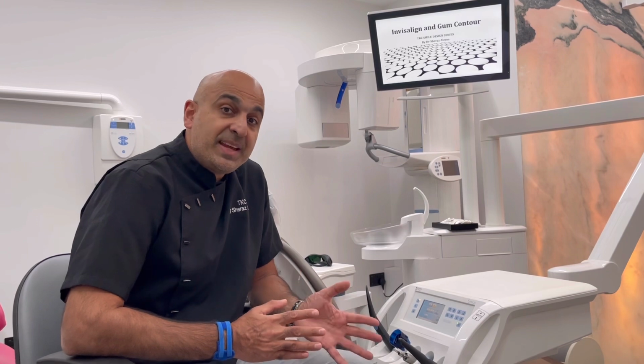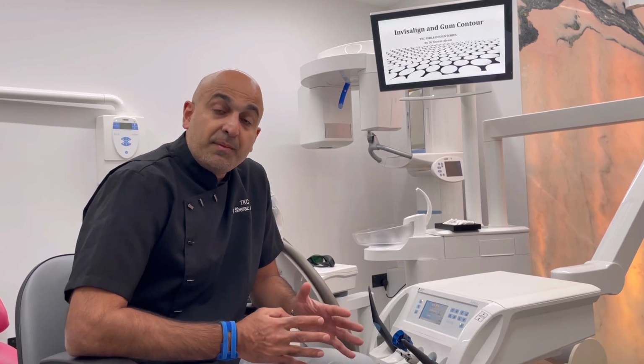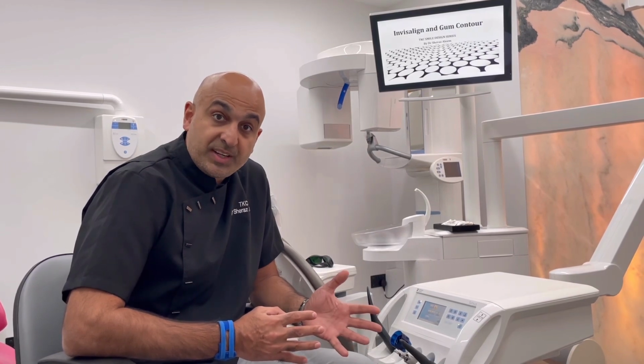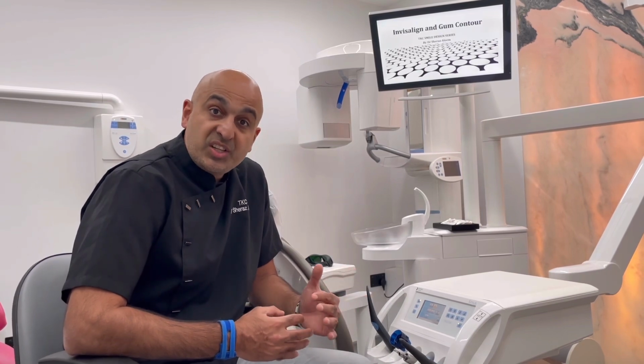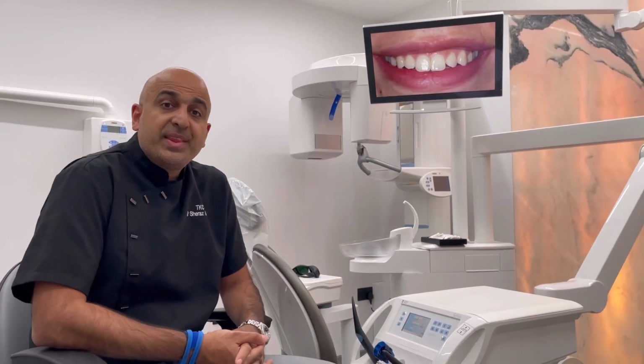contouring. Gum contouring is quite a well-known treatment now, and we use a laser for gum contouring, a water laser. This gum contouring can be very basic, if it's just one or two teeth that need the gum margins corrected, if they're not level, or it can be much more advanced if you're correcting a gummy smile with surgery. If someone's got a gummy smile, then we use the laser with water to correct this by removing the bone as well as the tissue, and that really helps. So we do both. Let's start with this case.